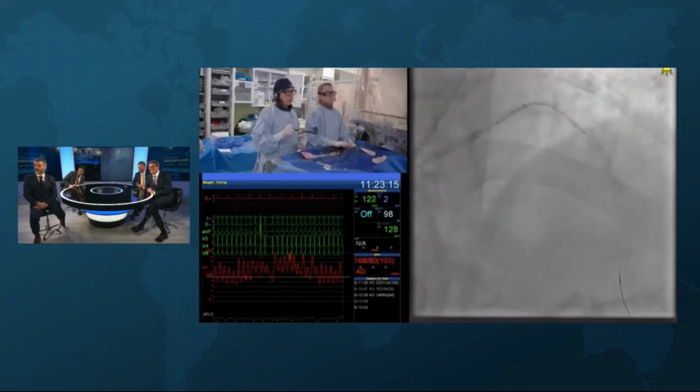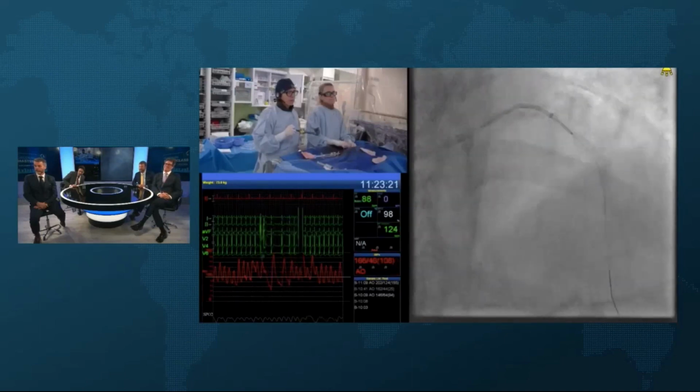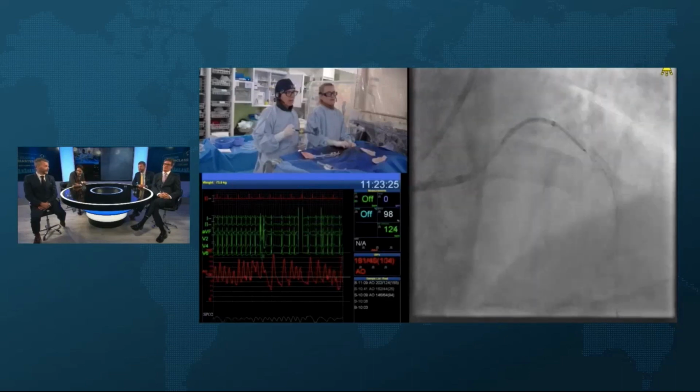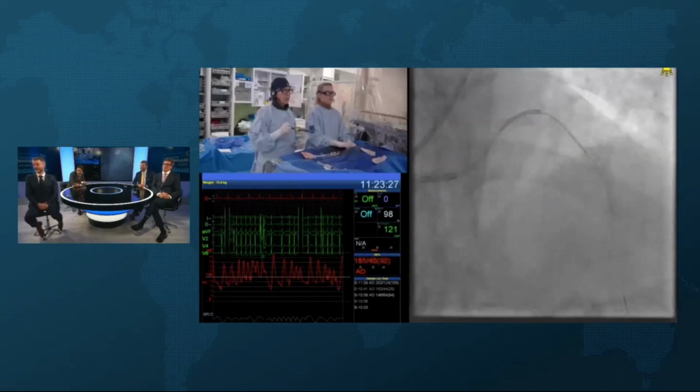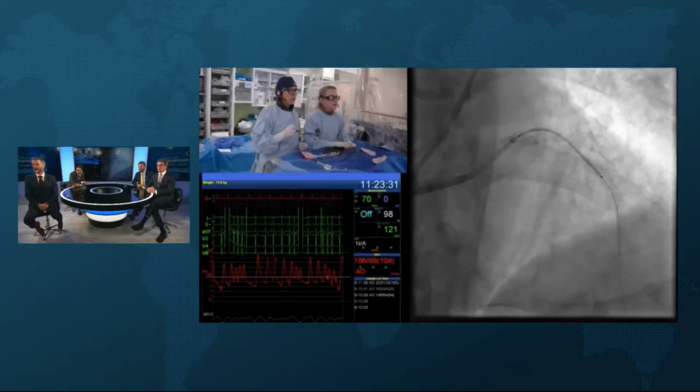And this is what we saw with the guide extension, should I take my guide extension out? Well, I could just do that. Like we saw how difficult it was. Take your guide extension out, and you're in a world of pain there. You're just starting over. I think it jumped forward. There it goes, yeah. There you go.